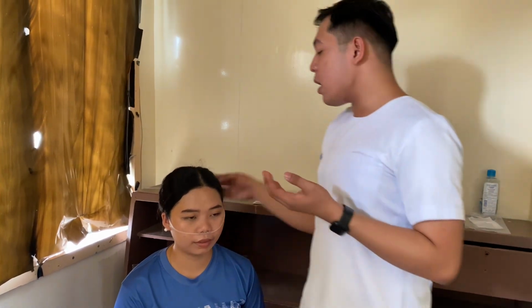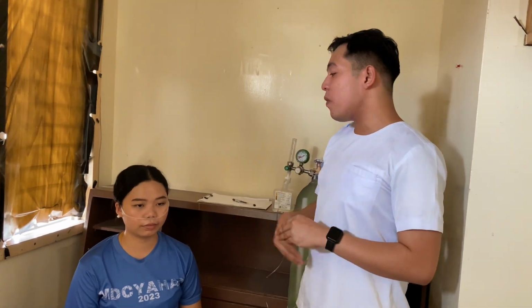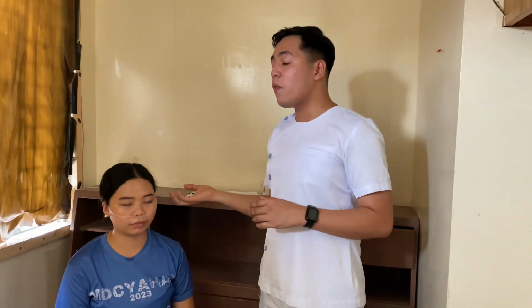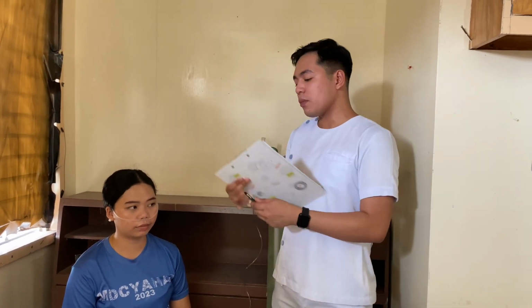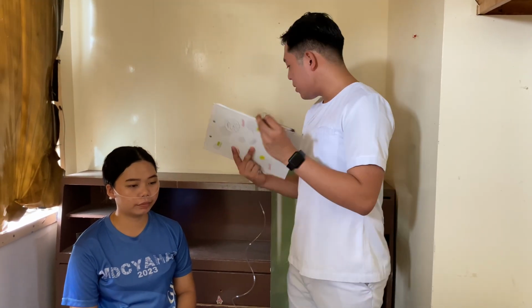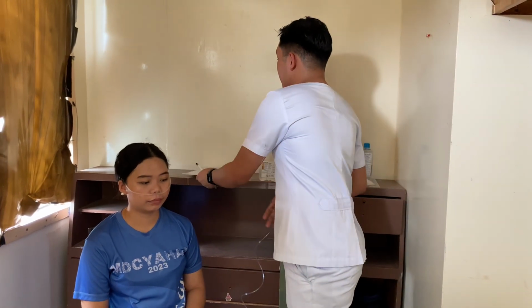After we place the nasal cannula, of course, we need to check if the patient is comfortable. Since we already asked our patient and she said she is comfortable with that, we need to record the patient's prescribed flow rate. Since our flow rate earlier was 3 liters per minute, it is changed to 2 liters per minute, so we record that here. So in that case, we have already finished the oxygen administration. Thank you.